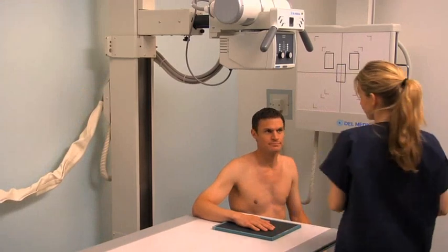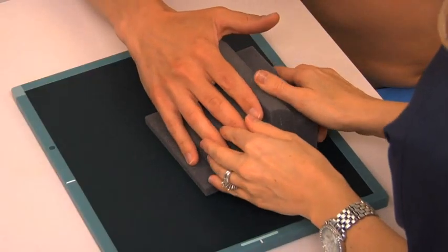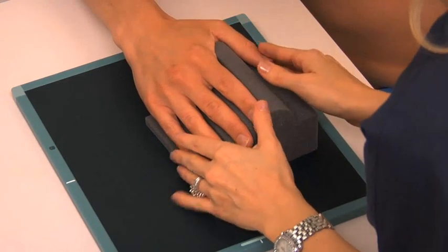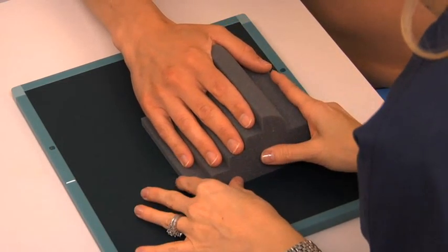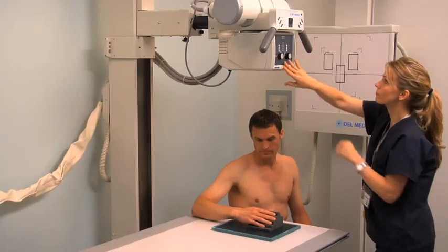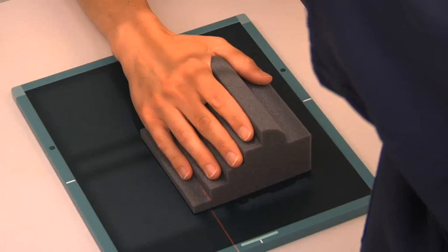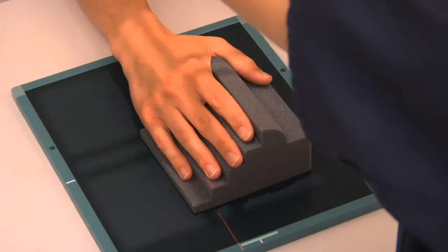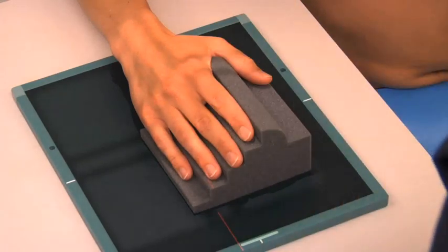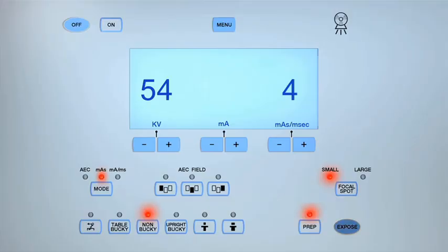To obtain a PA oblique projection, rotate the patient's hand, wrist, and forearm laterally 45 degrees. Support the palmar aspect of the wrist, hand, and fingers on a radiolucent sponge. Center the central ray on the third MCP joint. Collimate to include the bony and soft tissue anatomy of the fingers, hand, and wrist, including the distal radius and ulna, and expose the cassette.